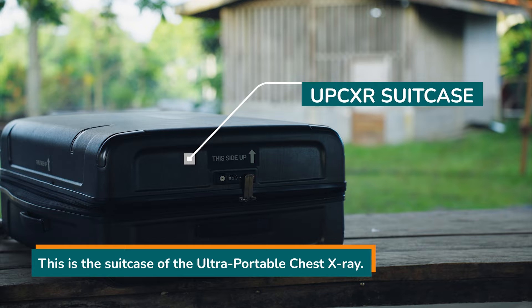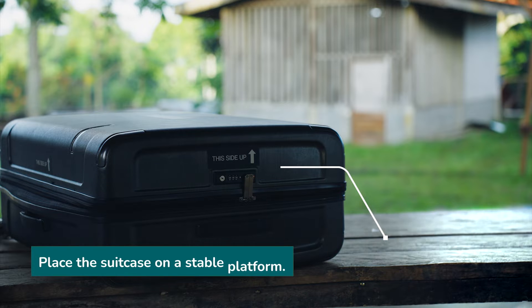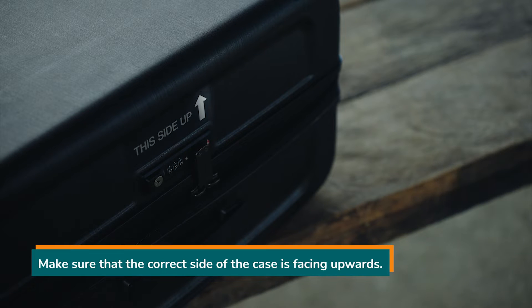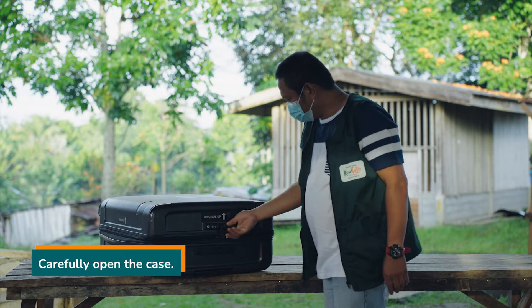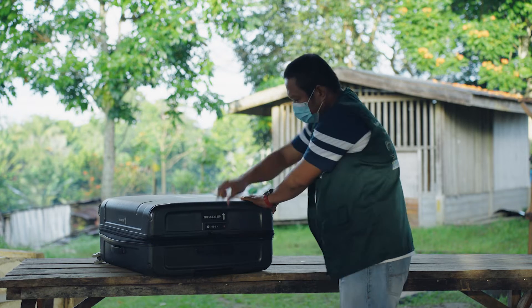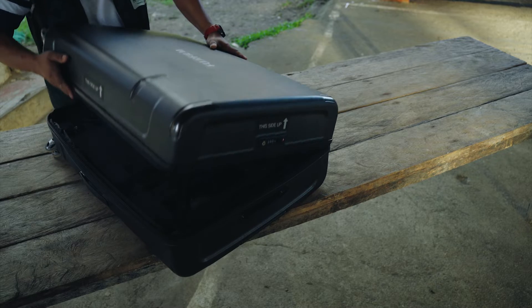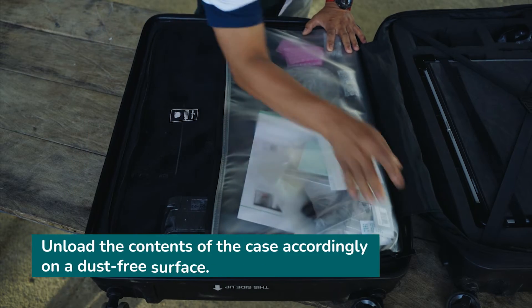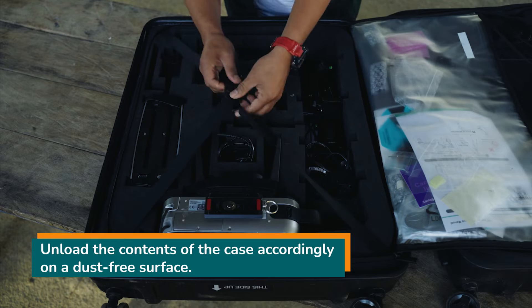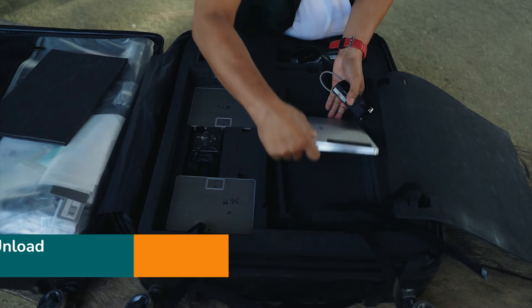This is the suitcase of the Ultra Portable Chest X-ray. Place the suitcase on a stable platform and make sure that the correct side of the case is facing upwards. Carefully open the case. Unload the contents of each side of the case accordingly — unload the tripod first, followed by the rest of the contents on a dust-free surface.